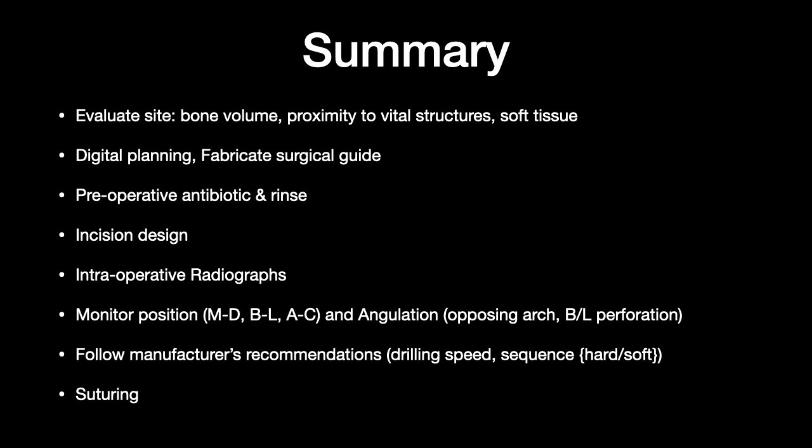In this particular patient, we did not have a steep lingual concavity, which is very fortunate. However, if some practitioners perforate the lingual plate, it is a concern because there are vital structures there, such as blood vessels and nerves. We also have to follow the manufacturer's recommendations on drilling speed and sequences of drilling, whether it's hard bone or soft bone, which can be determined during the surgery. And after suturing, we have to make sure that we have as closed a wound as possible to minimize the chances of post-op infections. I hope this helps. Thank you very much.